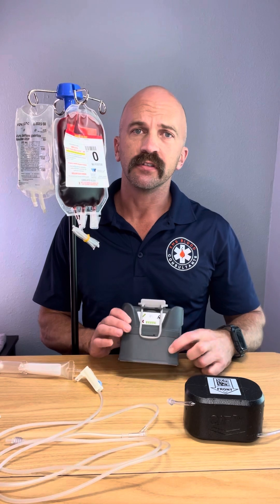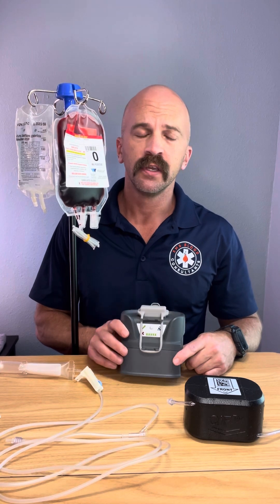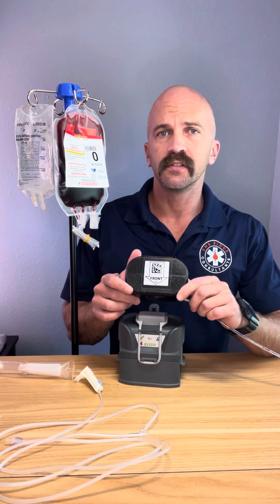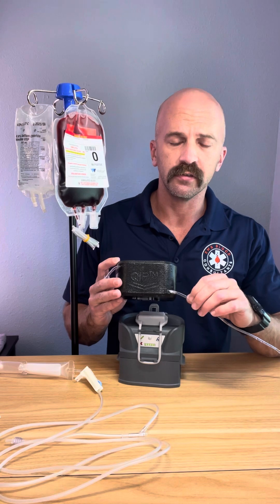It's got great battery life. You can see it's got a removable battery here. This one battery will last you at least four units of blood. All the heating takes place in this black styrofoam block here — this is the disposable part. It's got a stainless steel coil in there that the IV tubing runs through.